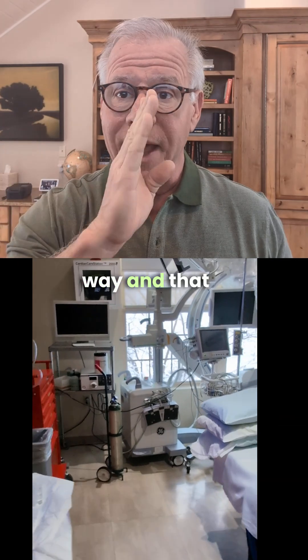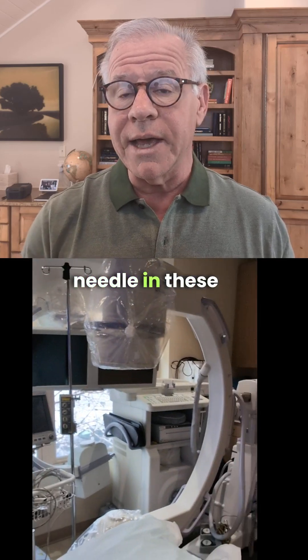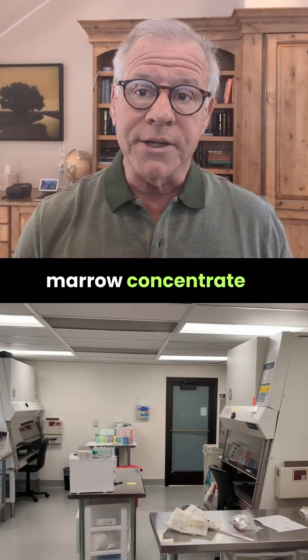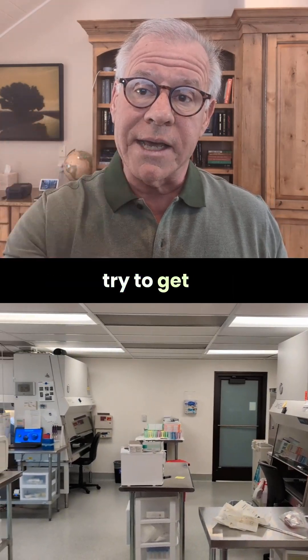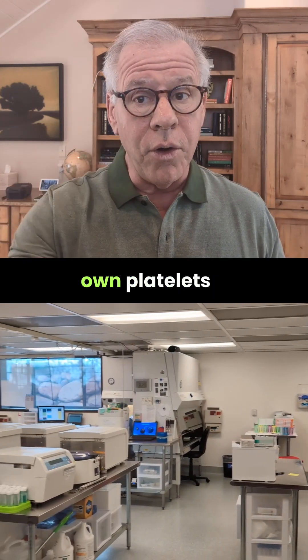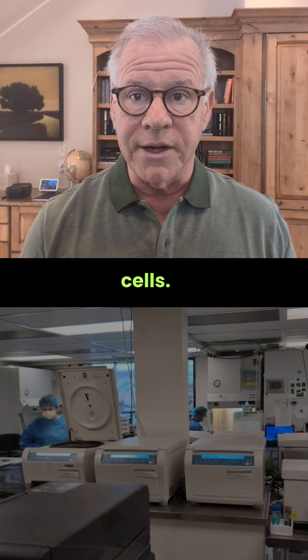So that's x-rays going this way and that way, so we can stereotactically place the needle in these very difficult to inject ligaments. We inject bone marrow concentrate to try to get those ligaments to heal, because that contains both your own platelets and platelet-rich plasma, as well as bone marrow stem cells.